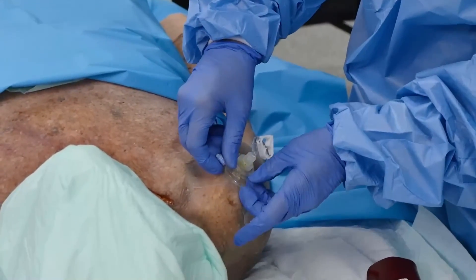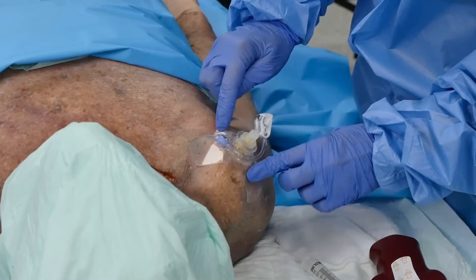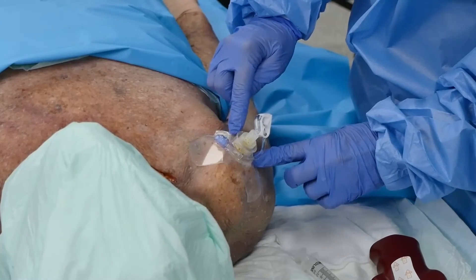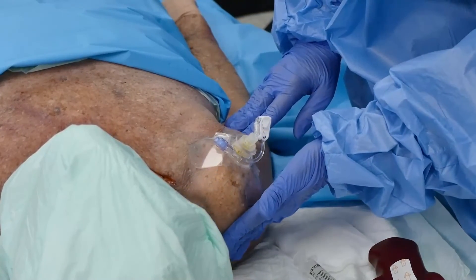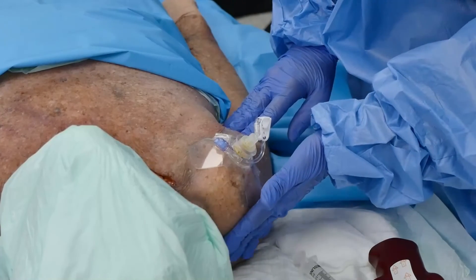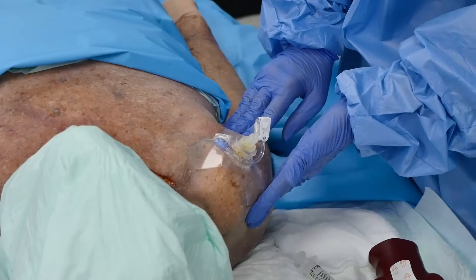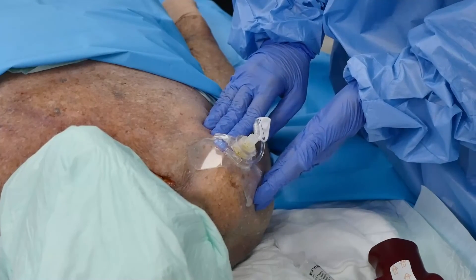I can attach this tab to the side here. As I infuse my fluids and medications per the physician order, I'm going to check to make sure there's no leaking around the site, and I'm also going to feel behind the extremity for any coolness, check for pallor, or any collection of fluid. Remember, that's going to be unlikely since the IO has a less than one percent serious complication rate.